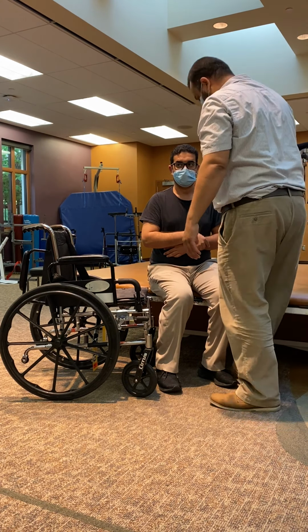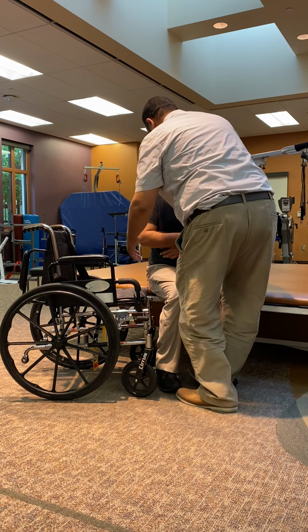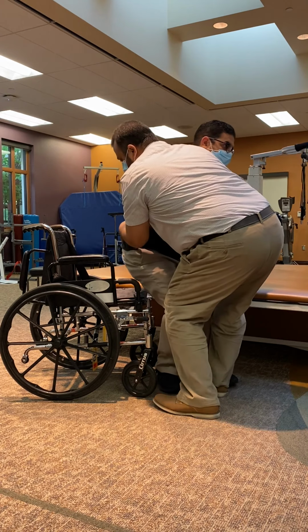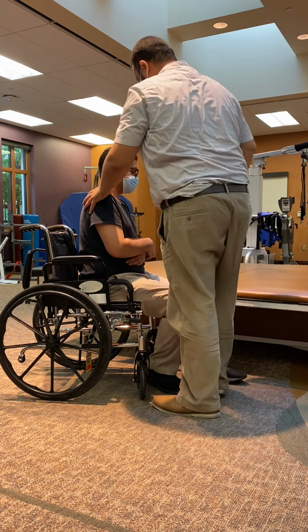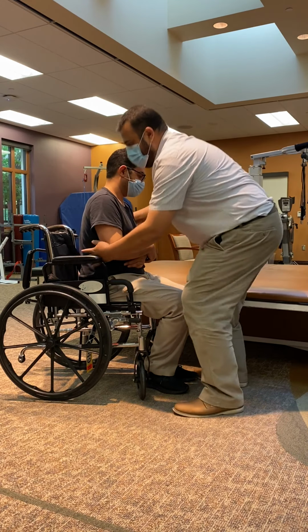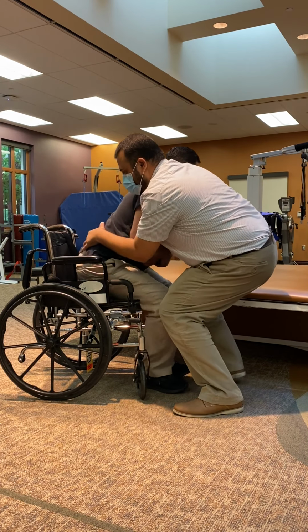I fix your feet. My hand is here. I'm going to block your knee now, okay? Lean over my shoulder, please. More. And get yourself there. Great job. I'm going to fix your foot here. Lean over forward and get yourself backwards.